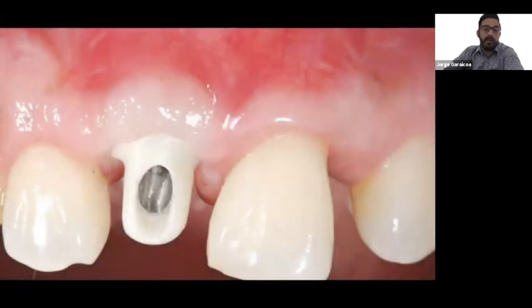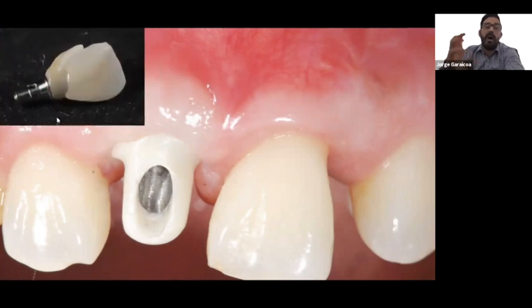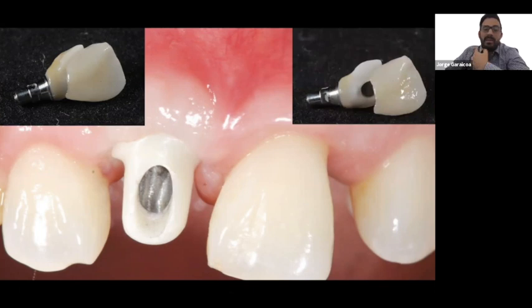Now there are designs where you can do partial crowns and then bond something on the facial, sort of like a veneer. I haven't done a design like this. I don't feel comfortable enough yet to do this. And again, if I were to consider doing this, I would have to have the margins super gingival, outside the gingiva, so I can finish them the way I want to. So for me, I still see a lot of limitations when I do things like this.